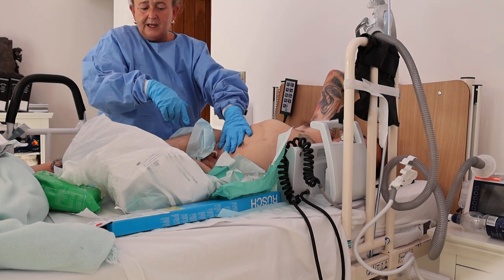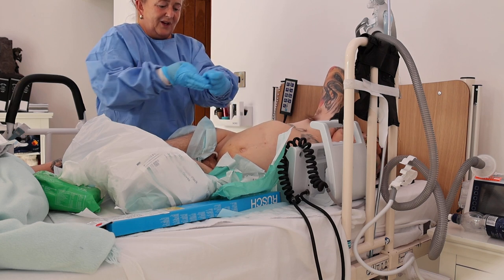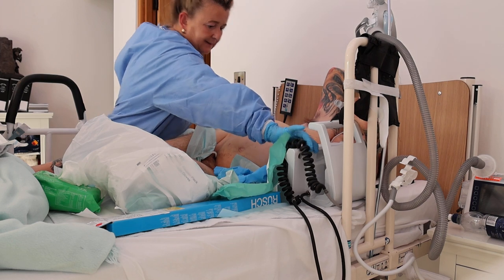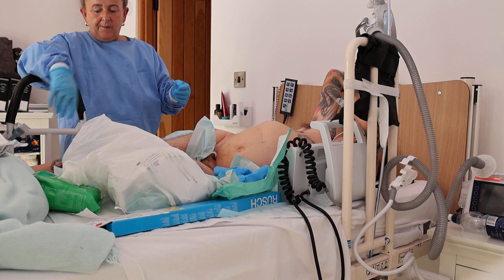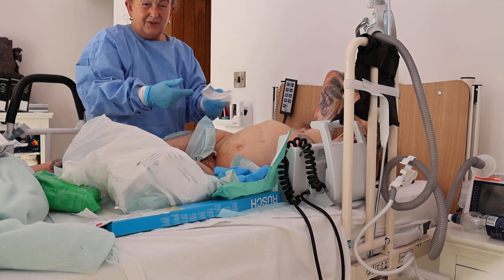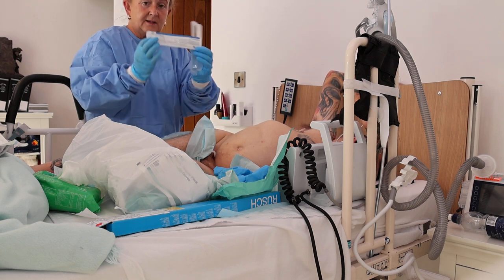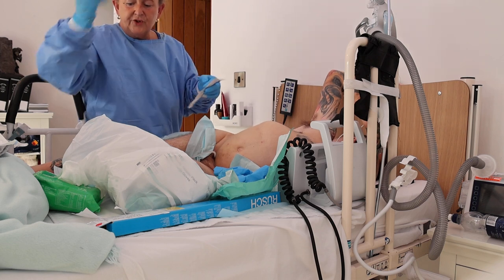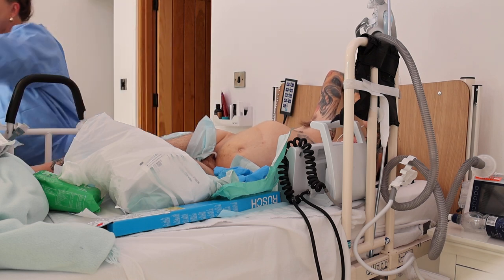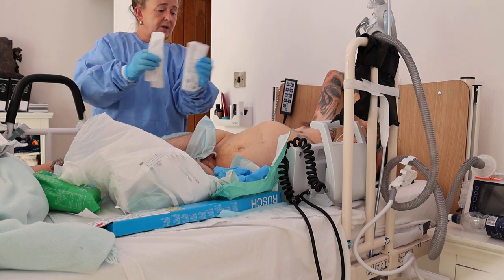I will now clean them all up. I'm going to get rid of all this, and I will also take one of my gloves off, because I've got three sets on one hand, and I can do a reading now. Whatever you use, that instillagel is a form of anesthetic, and that's why I put it inside. Take off your pieces of paper, write your date and what you use. Remember to think of dates always. On your catheter, you always take this off and put your reasons behind it.